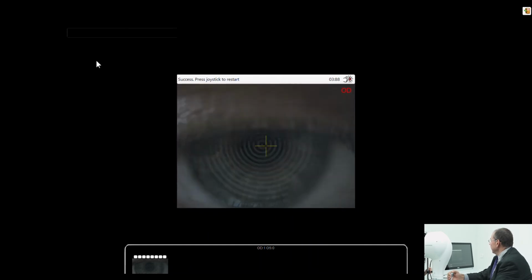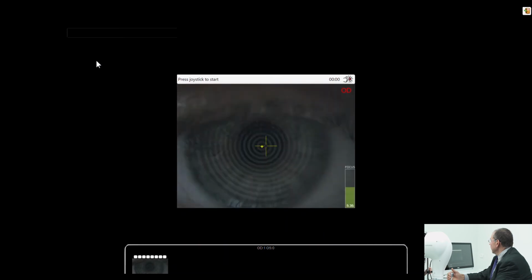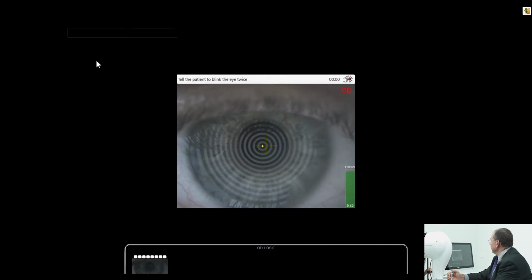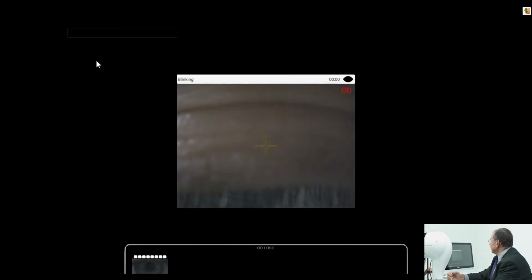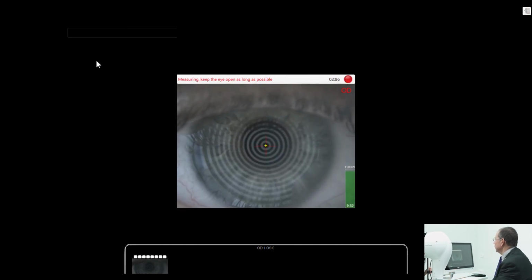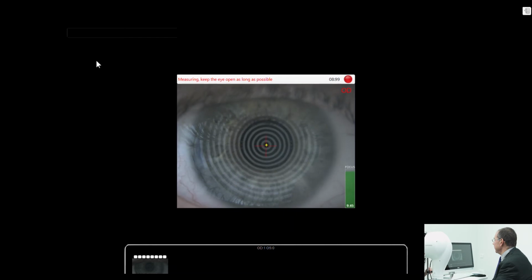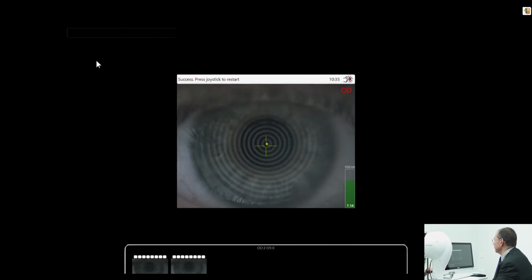Okay, now blink twice, and let's do it again. Blink twice, once, twice. That's great. Don't move. Keep your eyes open wide. You're doing great. You're doing fantastic. Wow, excellent. Right. We got to 10 seconds.